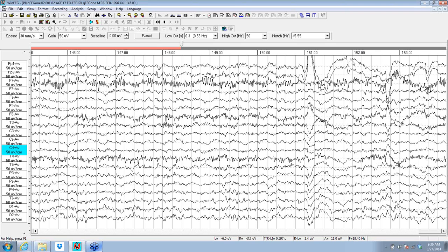In Europe, they have an approach to looking at the EEG called a vigilance model. And for them, they like the eyes closed recording to last a minimum of 10 minutes. Now, obviously, that's not 152 seconds, and this isn't eyes closed. But the reason that they want that continuous, without cuts taken out of it to clean it up, is that they want to look at the ability of the person to maintain vigilance and just to basically stay present and focused even though the eyes are closed.